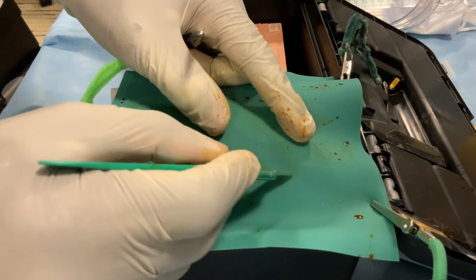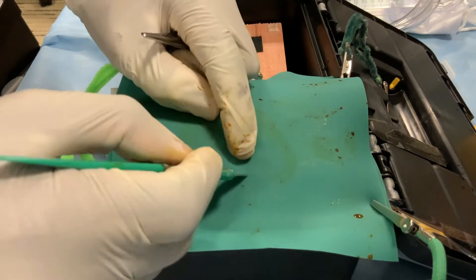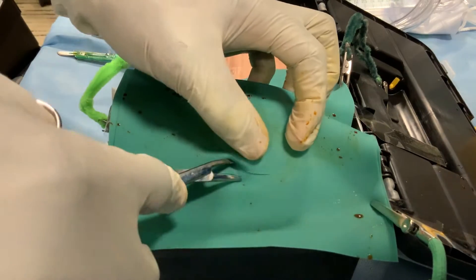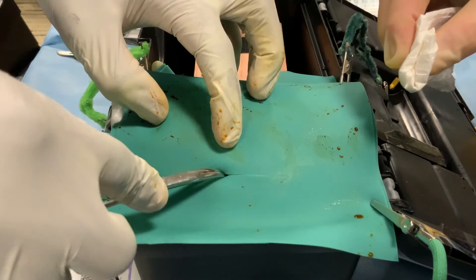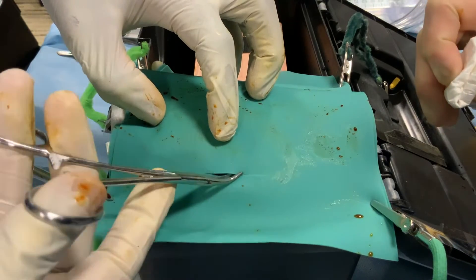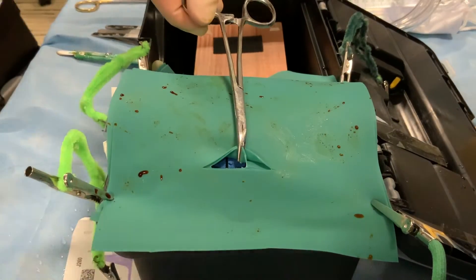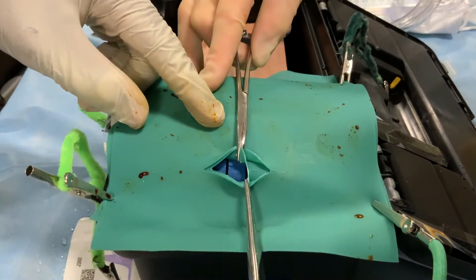A transverse incision is then made approximately six centimeters wide at two finger breadths, or four to five centimeters, above the pubic symphysis, here represented by the border of the box. The incision is spread vertically, and an assistant can dab any bleeders. The skin and subcutaneous tissue are gently clamped together at the two midpoints of the horizontal incision and retracted in either direction vertically to open the surgical field.